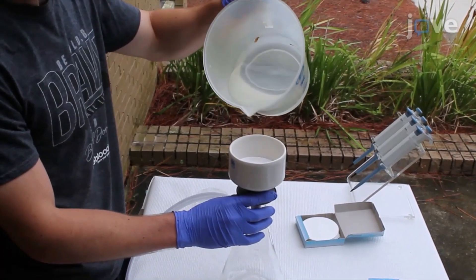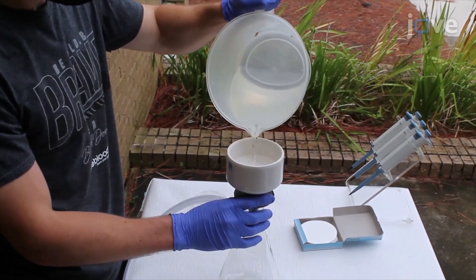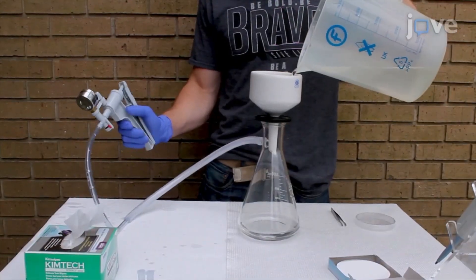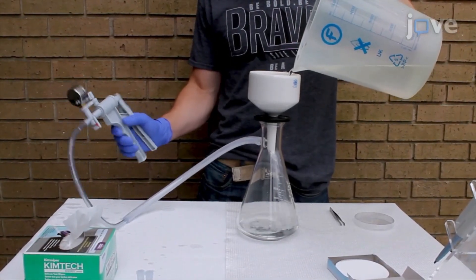Slowly pour between 50 to 1000 milliliters of test water over the filter paper inside the funnel while using the hand pump to create suction to pull the water through the funnel.